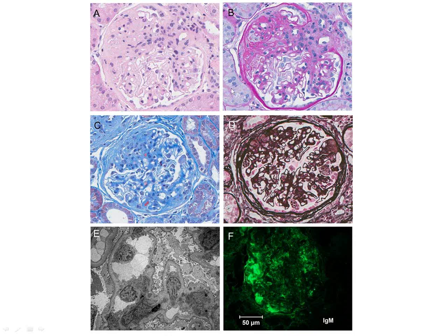So then my final diagnosis is that this is segmental glomerulosclerosis, and the overall disease process is likely focal segmental glomerulosclerosis. I couldn't say focal glomerulosclerosis based on the panel because I'm only looking at one glomerulus, but I think it fits into that disease category.